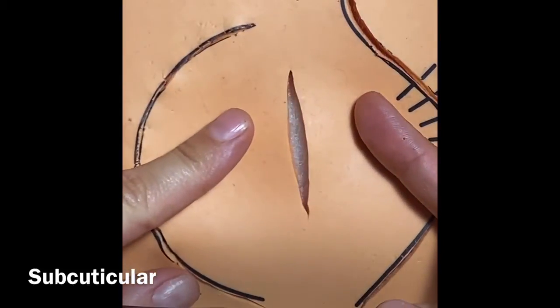This suturing technique is the hardest of all. It's called subcuticular and is used for surgical procedures in which the incision is long and you're suturing up the top layer of skin with a buried stitch the whole way and the whole thing is running.